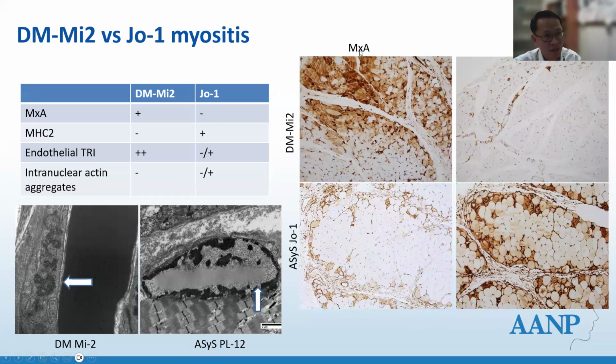Now, if you don't have these two antibodies, you can use more traditional ways, like EM. For dermatomyositis, both the MI2 variant and NXP2 variant will have very frequent and easy to find endothelial tubuloreticular inclusions. In antisynthetase syndrome, usually these inclusions are very rare or absent. And occasionally you can see these intranuclear filamentous inclusions. So these are actin filaments. These are pretty rare events. I have more than a dozen antisynthetase syndrome cases, and there is only one case where I found this, but it has been reported.